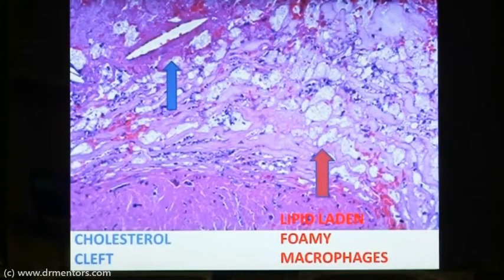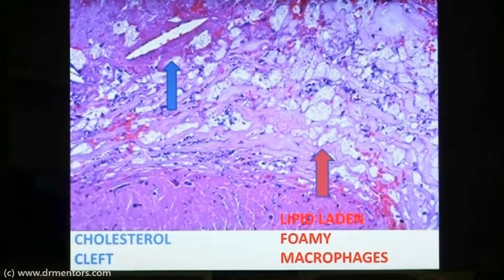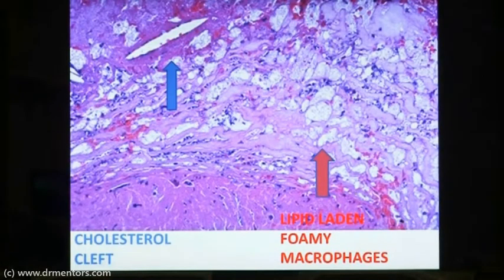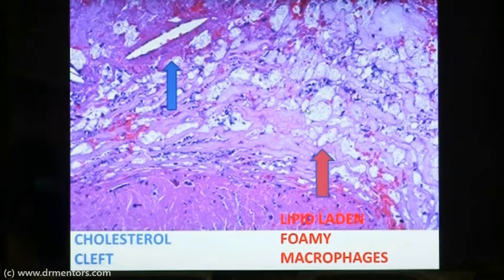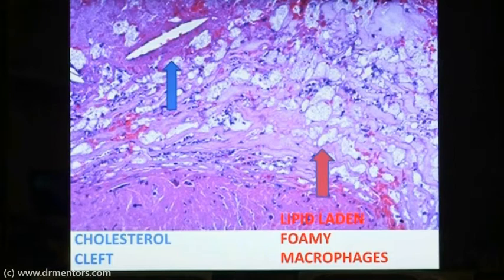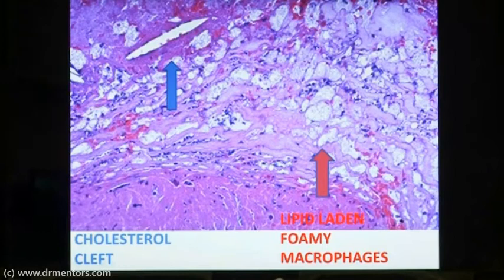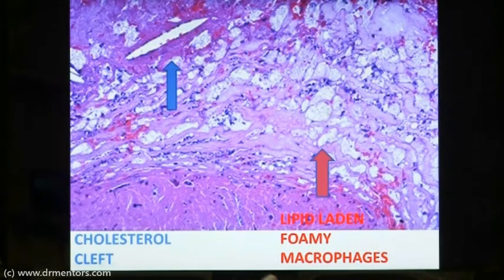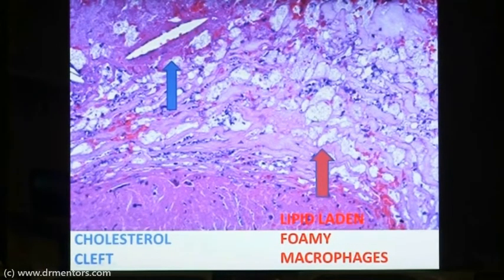This is the microscopic picture of the atherosclerotic plaque. Here you will be able to appreciate both the intracellular and extracellular accumulation of lipid. These are the lipid-laden foamy macrophages — foamy macrophages are nothing but macrophages which have engulfed fat droplets. This is the boundary of the macrophage, and inside you can see the foamy appearance due to the engulfment of fat droplets. This represents the intracellular accumulation of lipid.